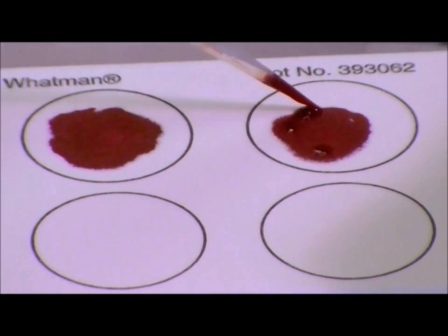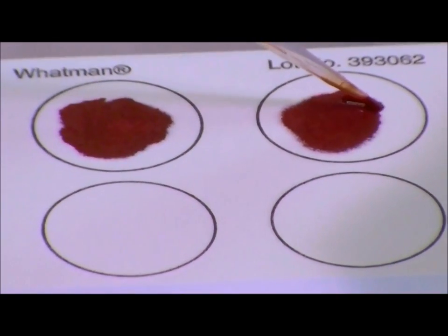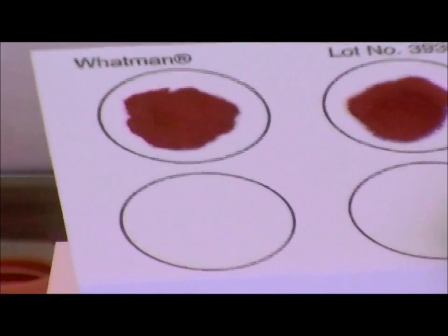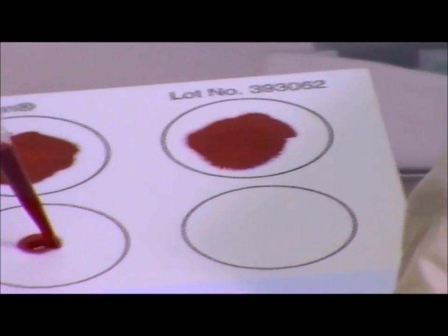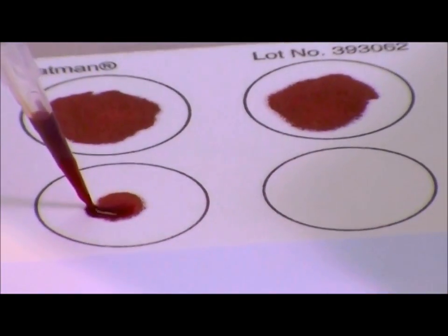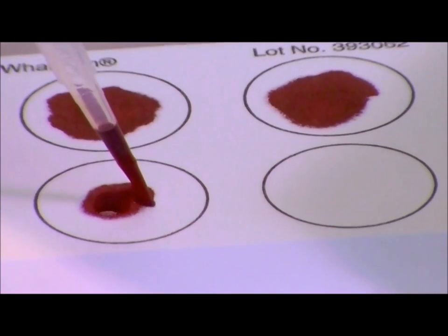If using blood from a finger stick, apply 60 to 70 microliters or two drops of blood to each circle. Use at least three circles for a total volume of 200 microliters.